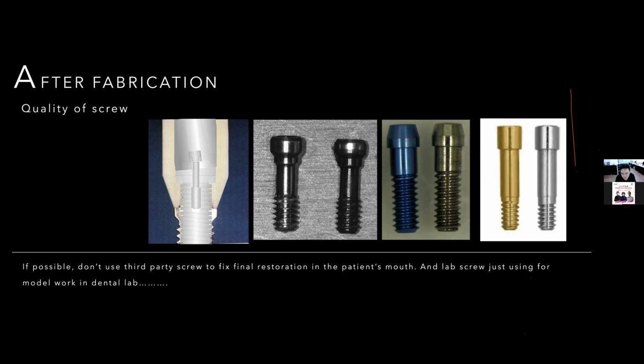So please remember, don't use the lab screw in the patient's mouth, or don't use the third-party screw for your customer. This is very important.